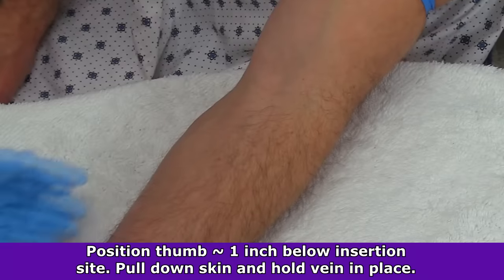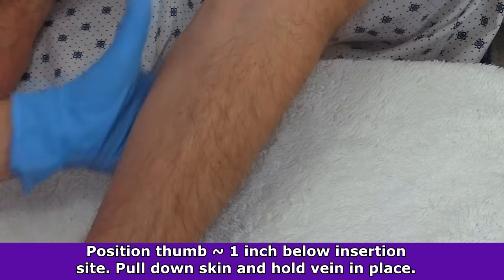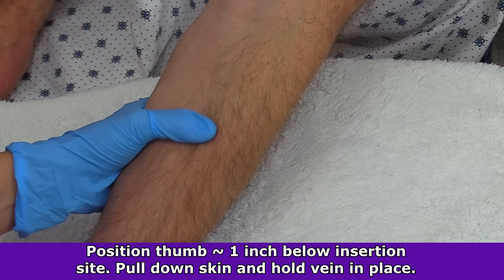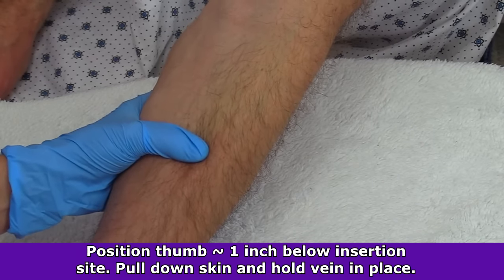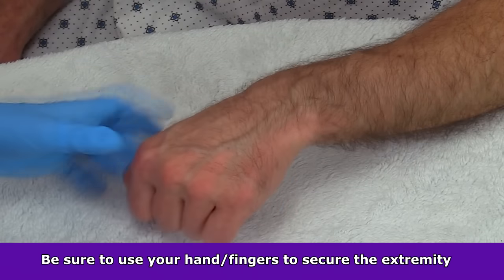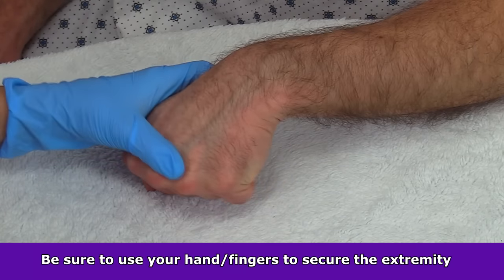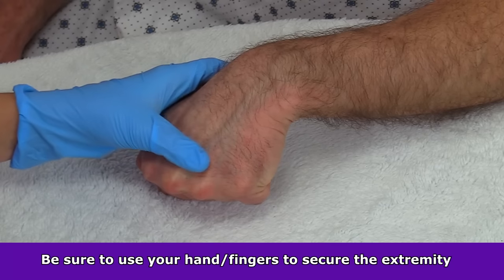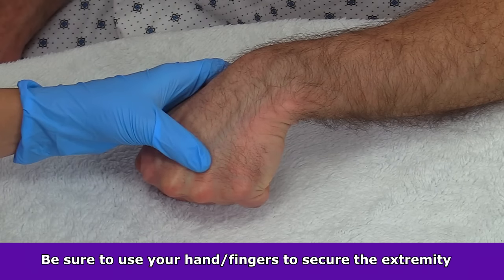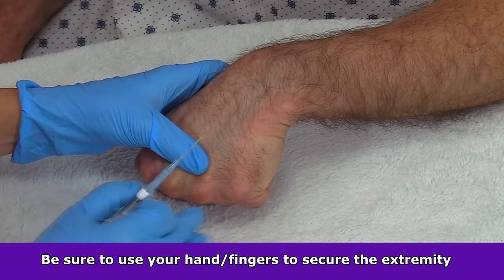The second important step in anchoring a vein is to position the thumb of your non-dominant hand one to two inches below the insertion site, then pull the skin down and hold the vein in place. This adds even more stability to prevent excessive movement of that vein. While holding the skin taut and applying light pressure with your thumb over the vein, use the rest of your fingers and hand to hold the extremity steady as you penetrate with the needle. Once you've performed all the necessary steps, you're ready to stick.